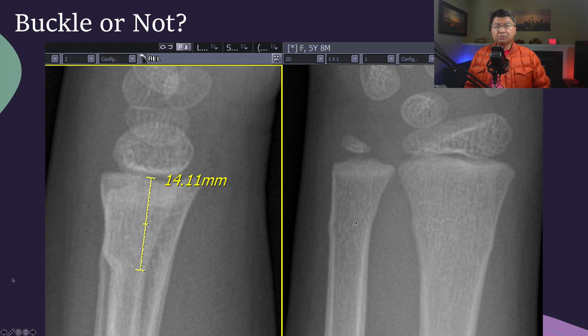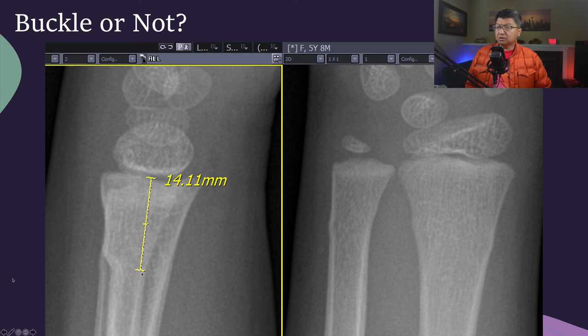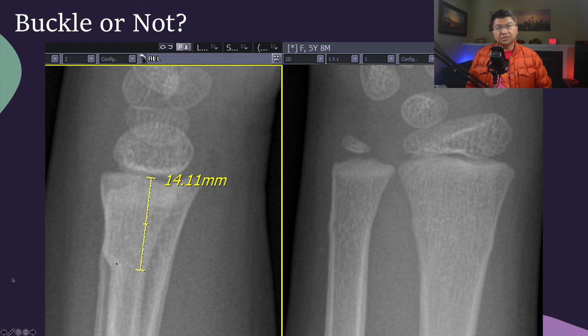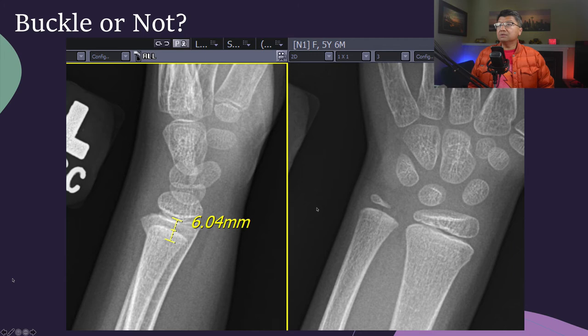Here is another radiograph. There is an ulna injury, but for the sake of this presentation we're going to stick to just the radius. This is a 5-year, 8-month-old child with a distal radius injury. The fracture-to-physis distance — drawn always from the bottom of the fracture line, which is usually much easier to assess on the lateral view — is 14 millimeters. There's no significant angulation and no significant cortical break that I can detect. So I would be comfortable calling this a simple dorsal buccal fracture.